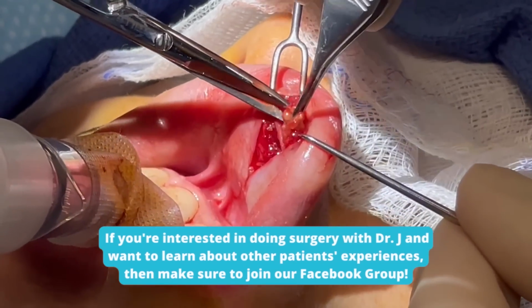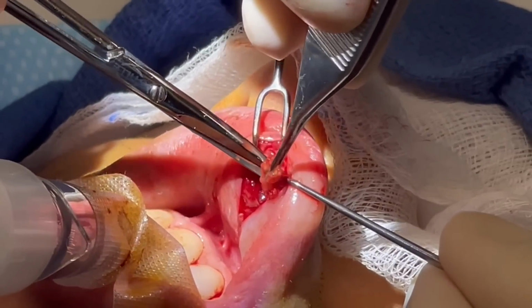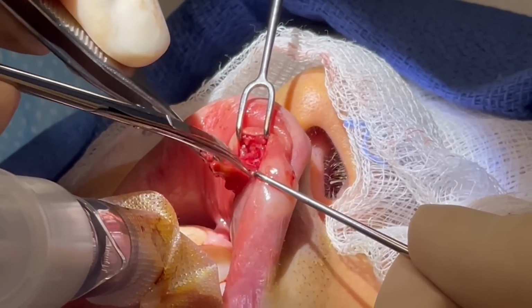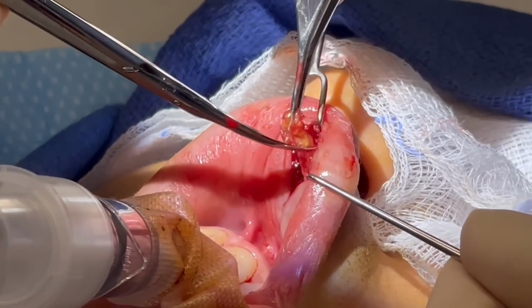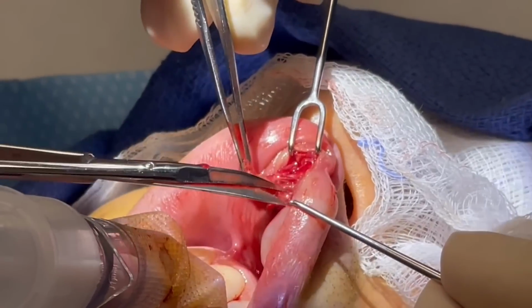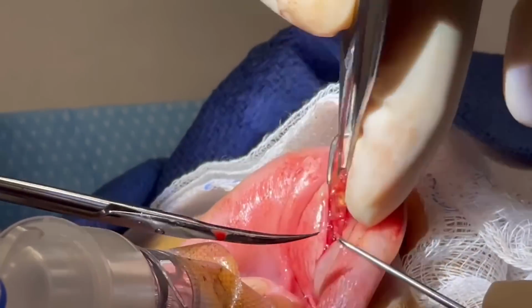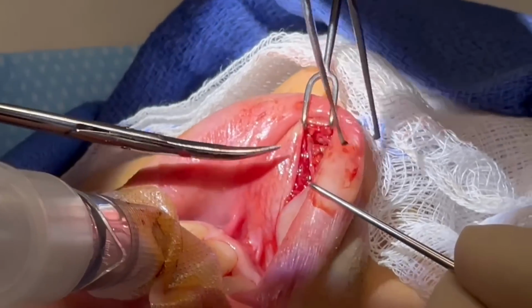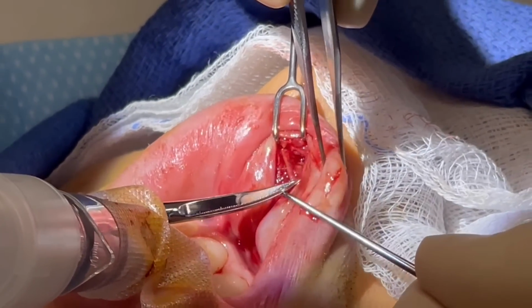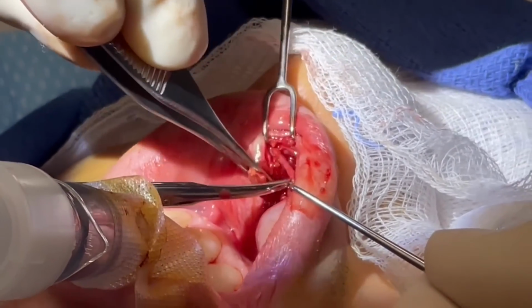The scar tissue or sac. Either way is good. Rubbing everything. Yep, you got it.